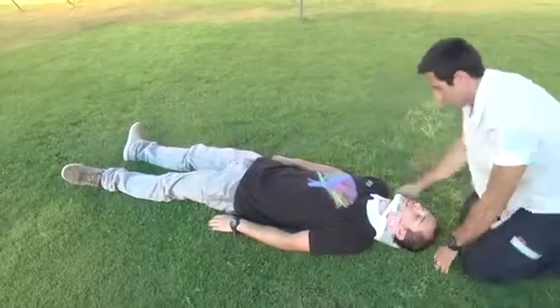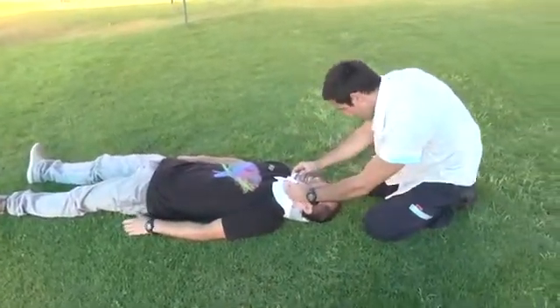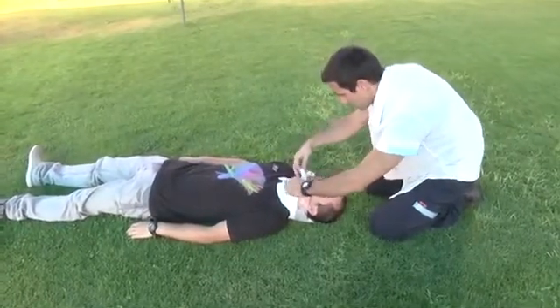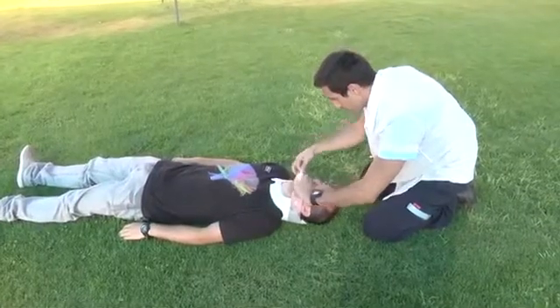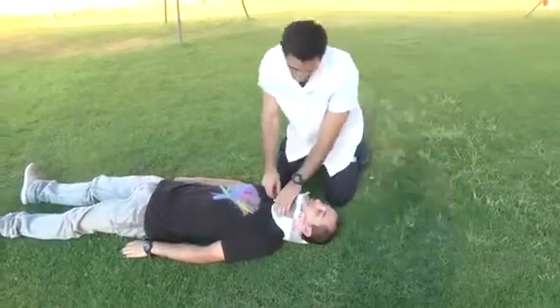If an advanced airway is needed, release the chin holder slightly and open the patient's mouth. You can insert a laryngoscope and perform an intubation, or an LMA or combi tube just as well. You can perform all these airways without removing the collar or compromising the patient's airway.